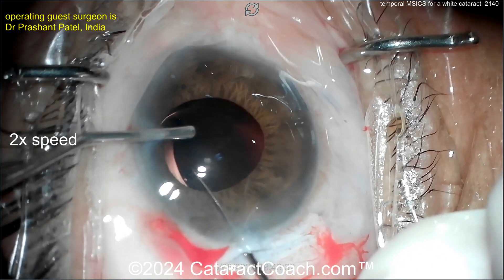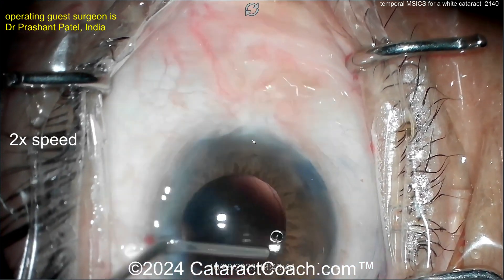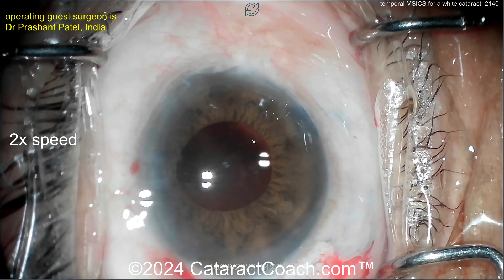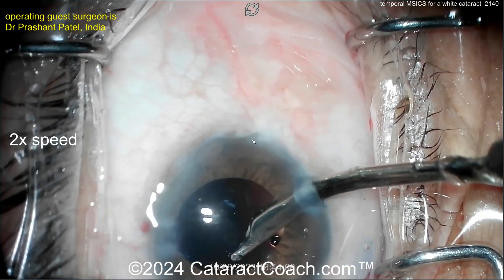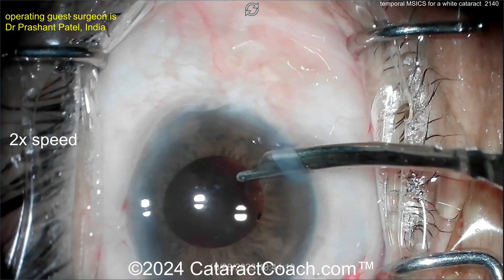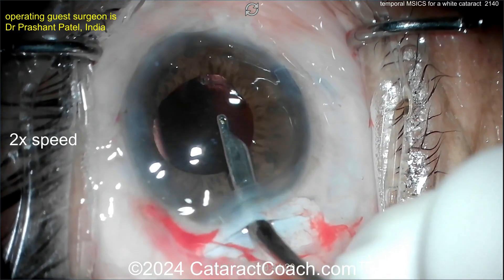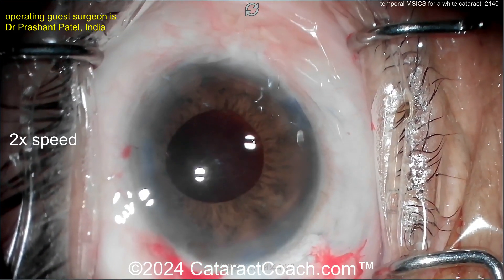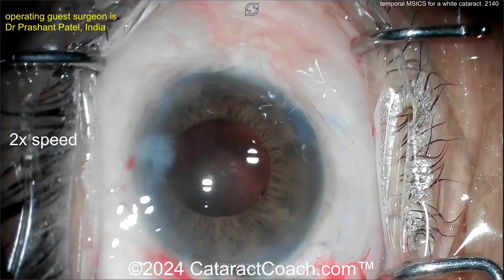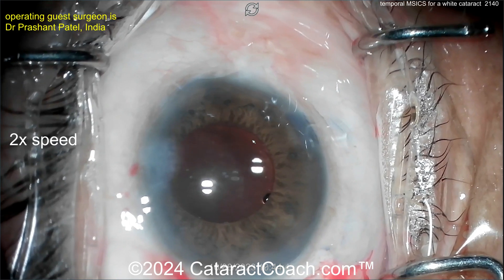For MSICS that I do in the U.S., I will still put a suture in the scleral incision — one or two 10-0 nylon sutures can be helpful to get the tissues properly opposed. But in the rest of the world, people do MSICS all the time with no sutures — it depends on your preference and comfort level. I'll spend an extra few minutes and put in a couple of stitches. Now washing out the viscoelastic with the Simcoe cannula. The lens is nicely centered and appears to be in the bag very well. Sealing up the paracenteses — it's a wide para so make sure it's fully sealed.